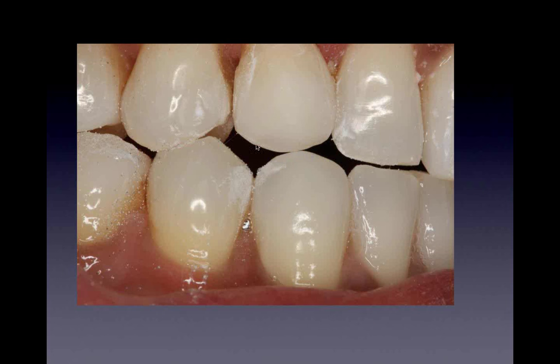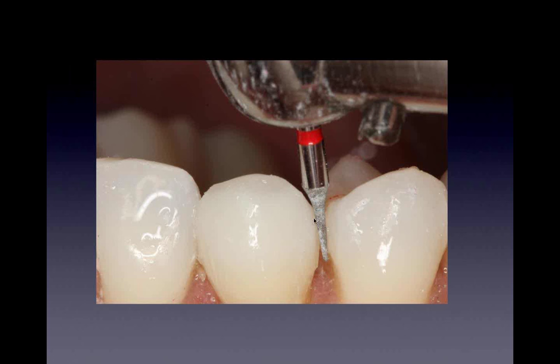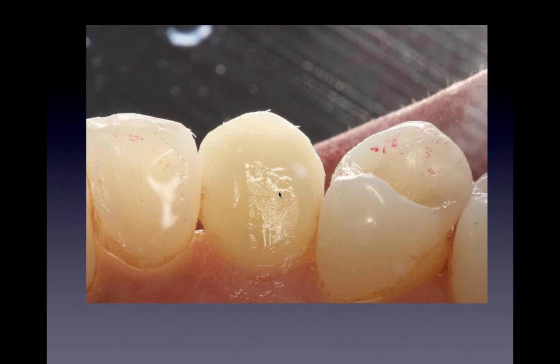So I'm still recontouring and adjusting until I get this to guide and this to be clear. Now, even this amount of space is still a little bit chancy. I'd rather have more like this. So I'll just take it down a little bit more and get that freedom. And then I'll go in with the mosquito and start cleaning up the interproximal. Start polishing it with my rubber wheels.